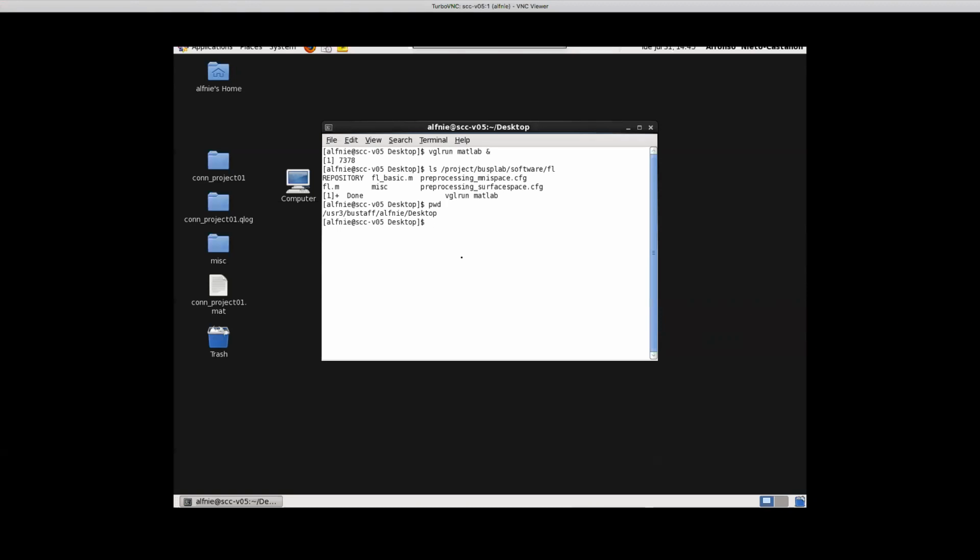You can actually interpolate within the vertices on that sphere to get the position of the vertices in FS average space within that sphere, and that is doing an interpolation within the surface-level data. So it's not looking at the volume-level data at all any longer. So you are first extracting the data from the cortical ribbon, and then once you have your surface-level data that contains a variable number of vertices, because that's each subject's own surface, then you reinterpolate the data, but now it's a 2D interpolation instead of a 3D interpolation to actually get the data into FS average space.